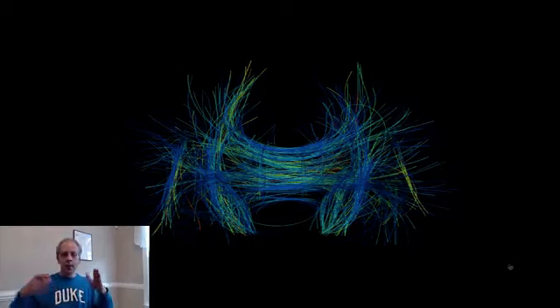So to recap, you go into the magnet, you get these magnetic fields in different directions, you compute the probability of having a cable or a fiber in a given direction, and when you want to get information about 2 points, you use the Hough transform to do a voting process, and you can get that connection. And this is not the only way to do that, it's just one way, and I think it's a nice way to illustrate how some tools that were developed for image segmentation are also applicable in this new modality.